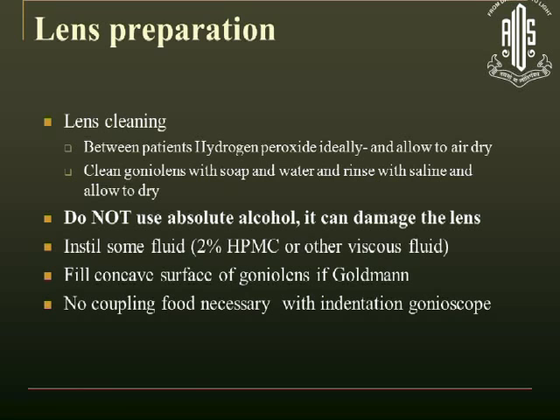Between patients, use hydrogen peroxide ideally, and it should be allowed to air dry. A practical thing we use is to have it in a petri dish just next to our slit lamps, and the lens is dipped in that and air dried before putting it in. So between patients, that's a useful, quick way of cleaning it. But at the end of the day, it's always cleaned with soap and water, rinsed with saline and allowed to dry. Do not use absolute alcohol since it's been found to damage the lens.